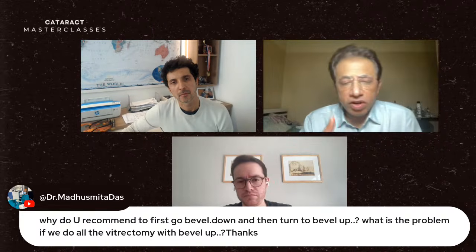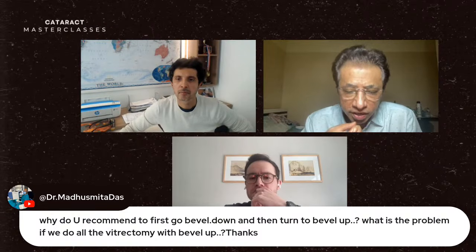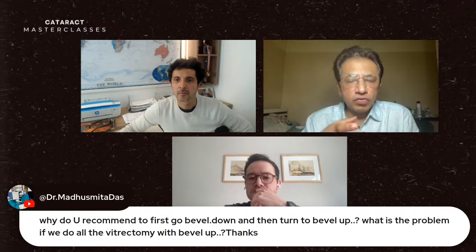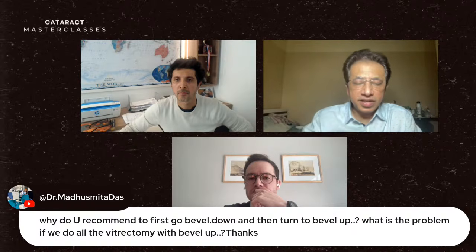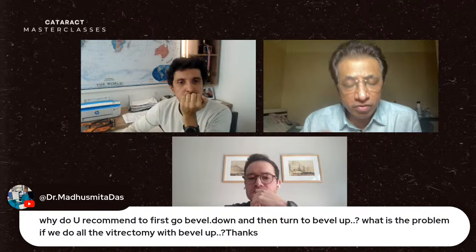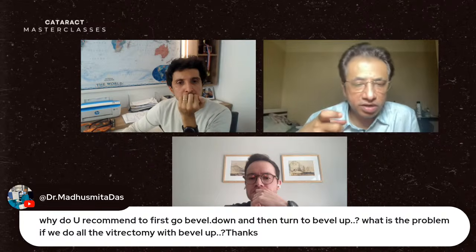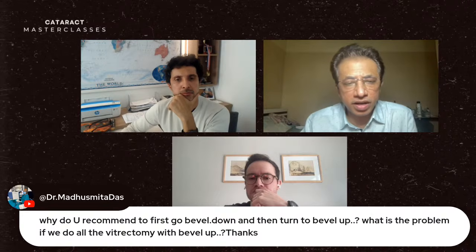That also can work, provided you are using the bevel posterior to the posterior capsular tear. It can still work. But my principle here is first to cut off the vitreous which is at the plane of the posterior capsule. That is what I would want to segment. That's the reason I would prefer to do it like this. If you want to go with bevel up, fine. That also is all right. But don't start it at the anterior chamber itself. Place it a little bit more posterior, at the level of the posterior capsular tear, and then do it.